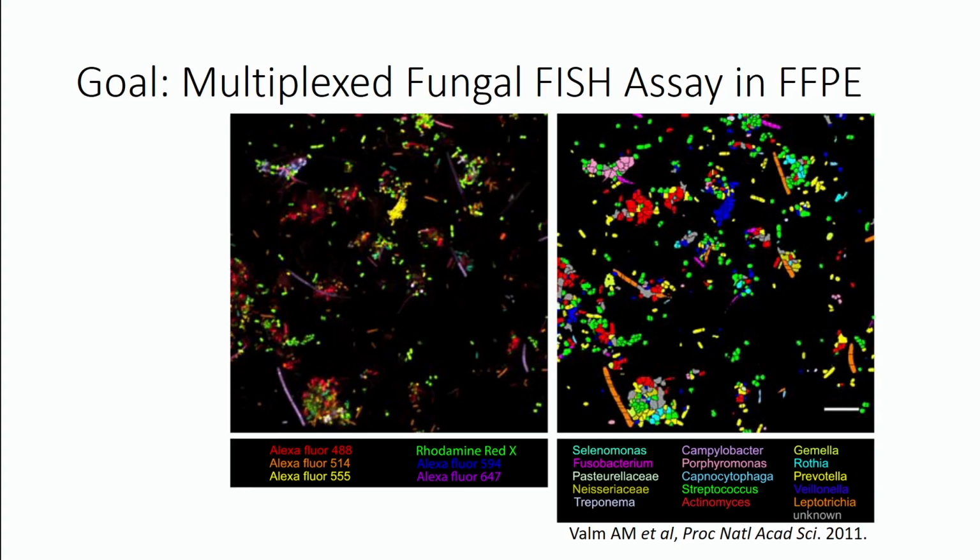And so you could think about a couple of ways to deploy this, either as a single pool or as multiple cascading pools of FISH probes. This has been done in bacterial colonies. So on the left, this is not my work, dispersed, or semi-dispersed, dental plaque. This is the real color image, or the fused image of imaging in 6 channels.